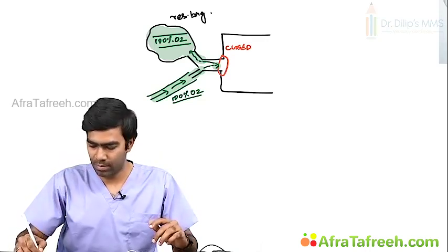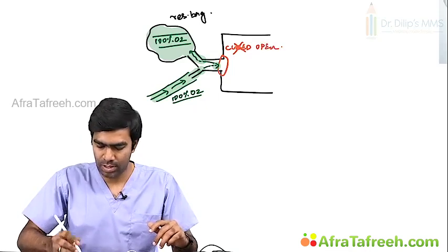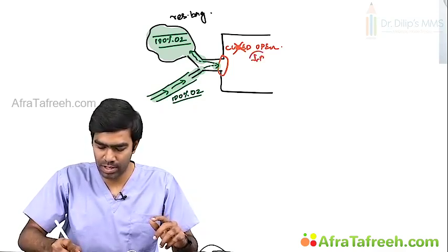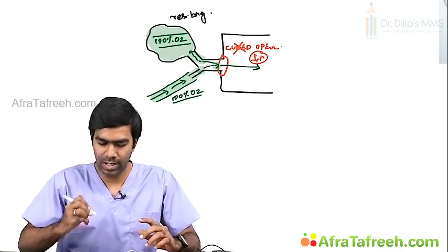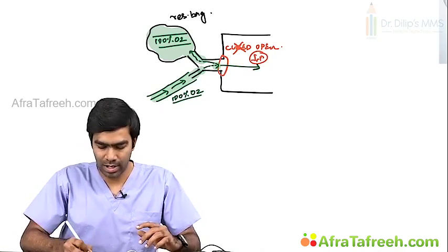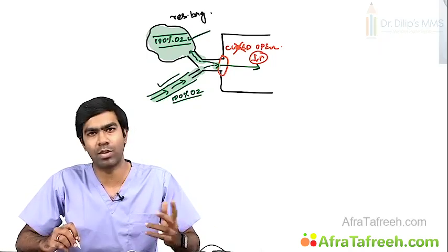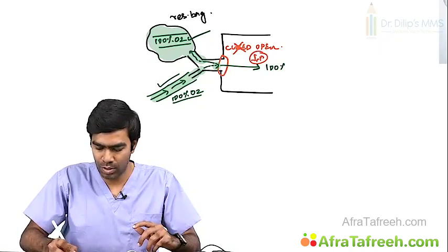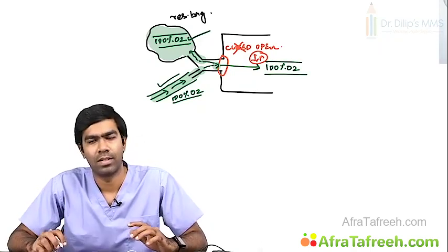So during that time, it will change from closed portion to open portion. So now the moment it opens and creates a negative pressure, because the negative pressure is there, that's why the inlet valve is opening. So now it's going to suck in gas through the inlet valve and the gas that is present in the reservoir is also 100% oxygen. The gas that is coming through the oxygen port is also 100% oxygen. So which means you will result in 100% oxygen in the self-inflation bag.